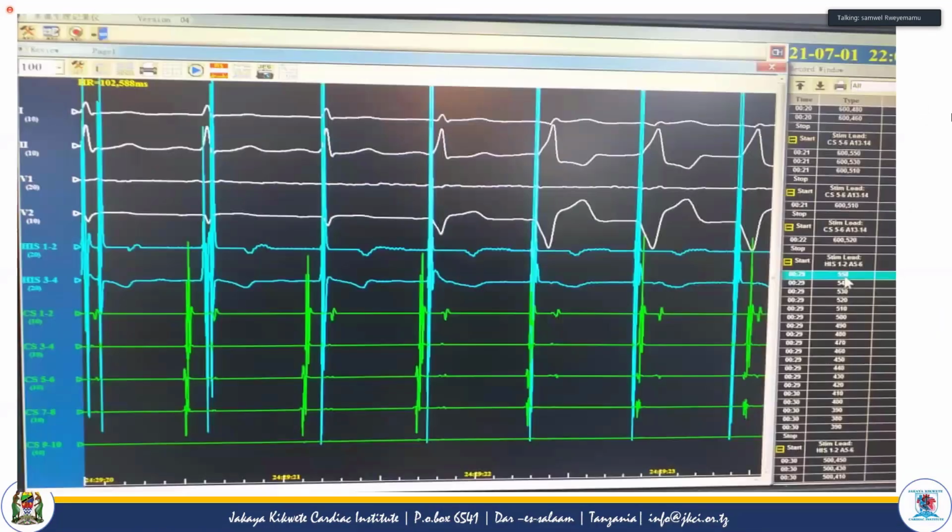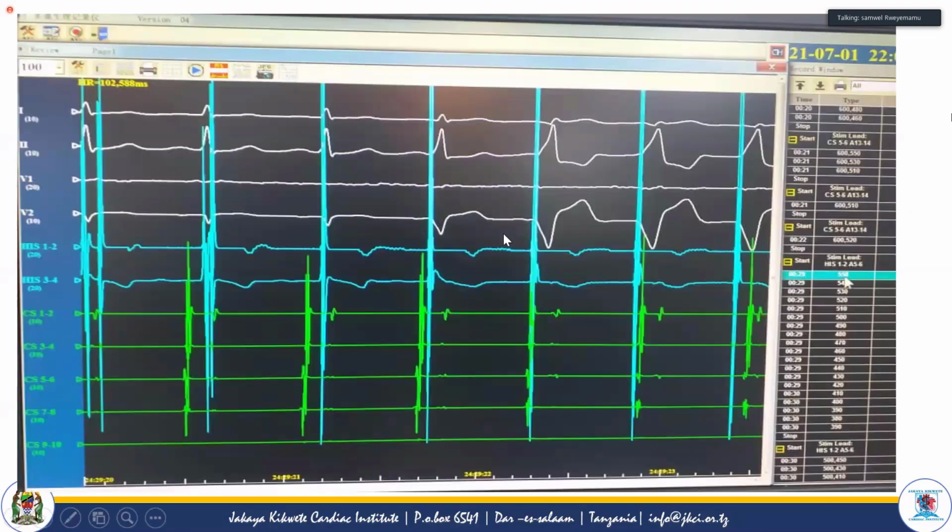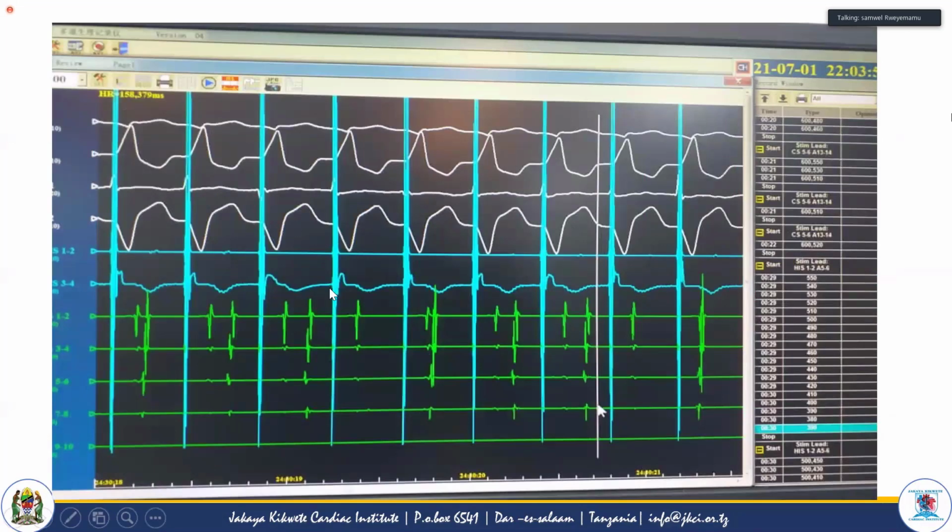So we went on getting some intracardiac information on this patient. And actually this time we are again pacing the right ventricle and you are getting the atrium, this one-to-one conduction. Again, here you find the QRS on the surface ECG take the form of left bundle branch block. Actually, this signifies that you are pacing from the right ventricle going to the right atrium. So as you go, you find this one-to-one conduction there.